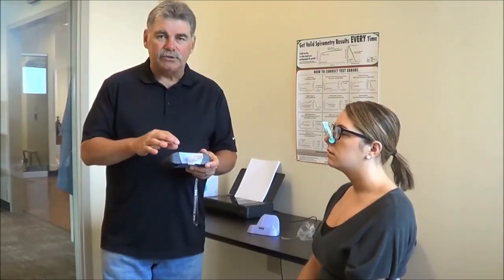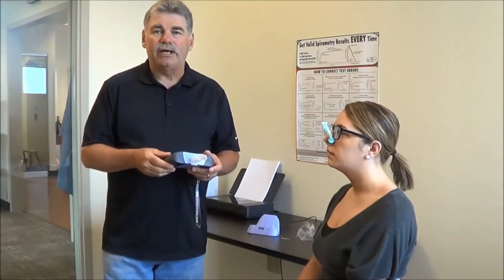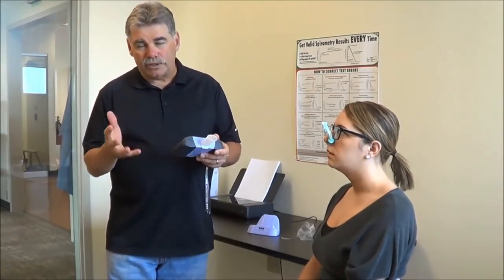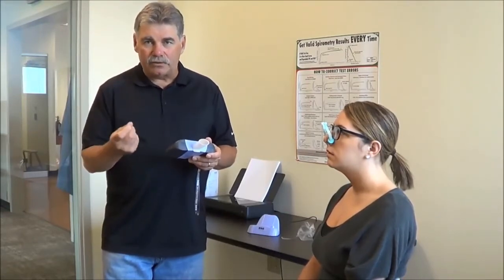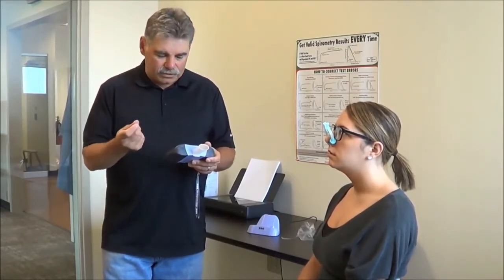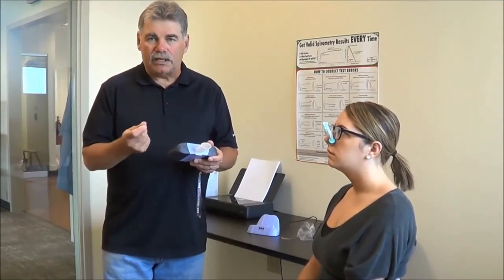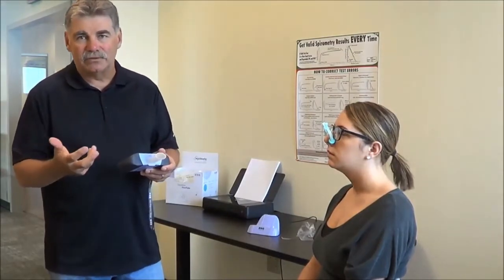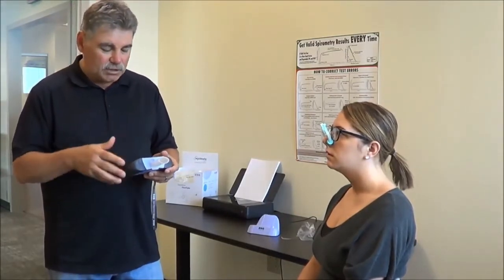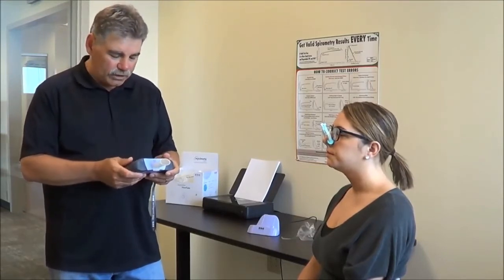So I got good effort due next, meaning that the second effort was acceptable, and I have a C grade right now, which is pretty good. We're on track. If I do another third good effort where the reproducibility is good, I hopefully will have an A or a B, which indicates that I've met the standards for a good spirometry test. So we're in good shape here. We got two blows behind us, we got one more to go.